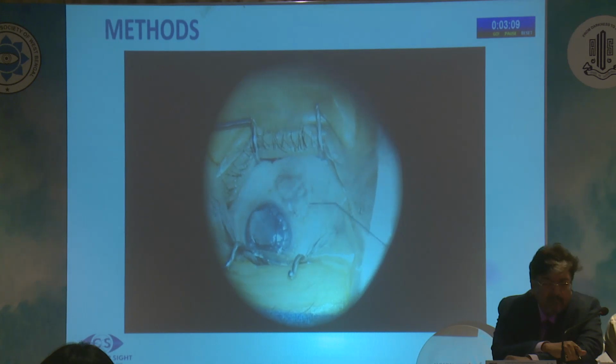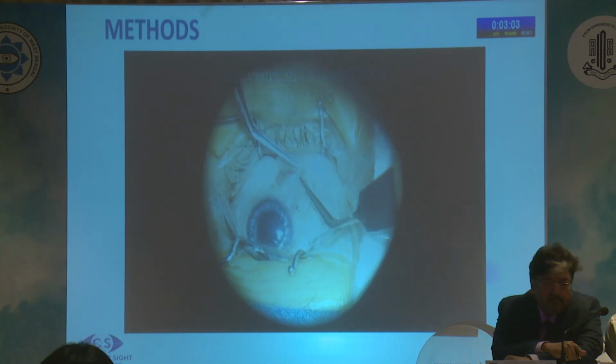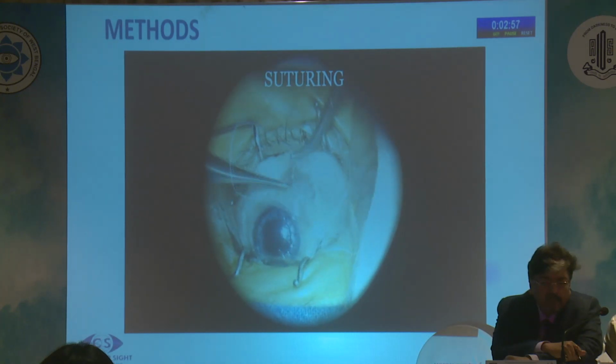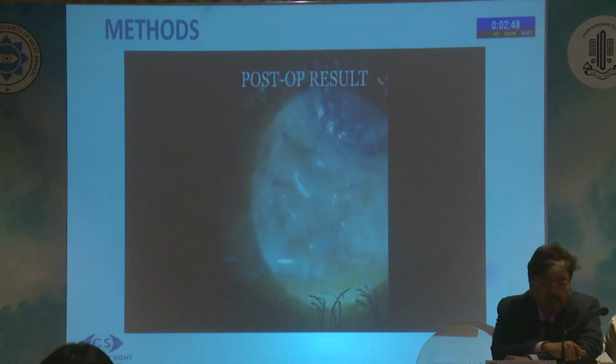A conjunctival patch graft obtained from the other eye was then sutured over this. This is the post-operative result.